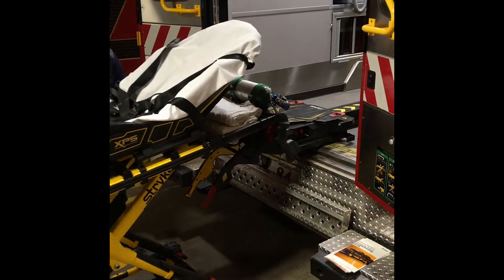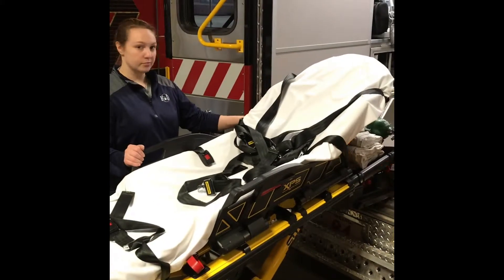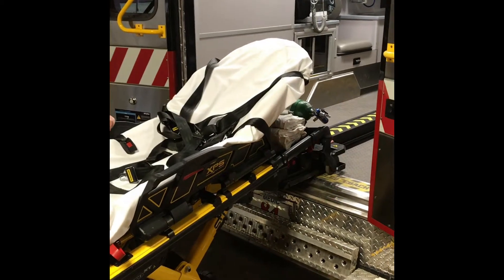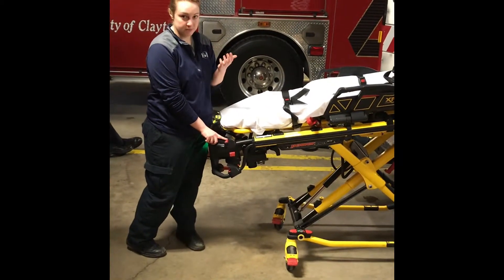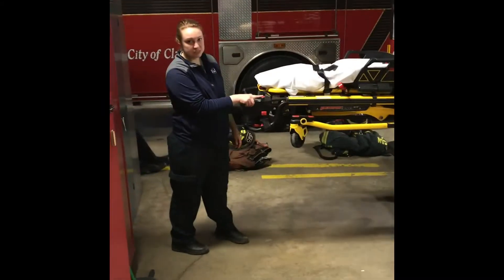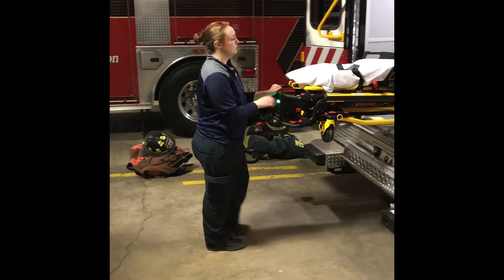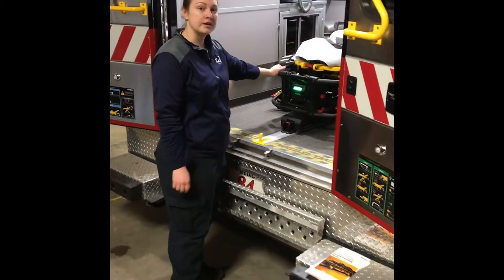Line up and simply push into place. As soon as those pins are in the right spot, these yellow flashing lights will turn green, and then it's ready to load. Lights are green. You hear it click into place. You're going to hit your retract button — that'll bring the legs up and the arms up. Once it's in this position, you can simply push the cot in and it will lock in place.